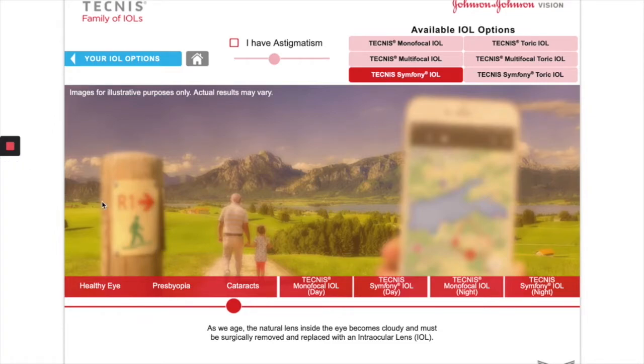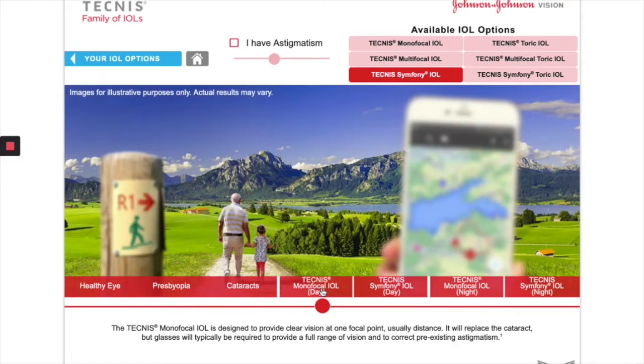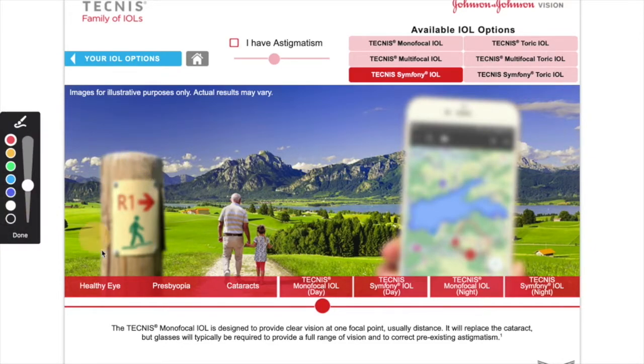Now, let's say you have a cataract. This is a simulation of the vision of what the cataract patient would see. Everything's blurry. The color hues are different. And now let's say the patient is interested in correcting the cataract and wants to put a regular lens in. So let's say we put a regular lens in here, and this is how the vision is going to end up. Good distance vision, so you can drive fine, but again, computer distance, which is the intermediate, and the close-up, which would be your phone, shaving, makeup, your watch, all going to be blurry. And you need glasses. Some people are fine with this.